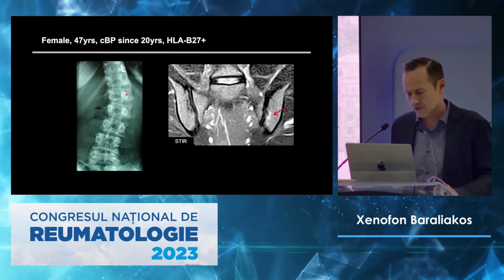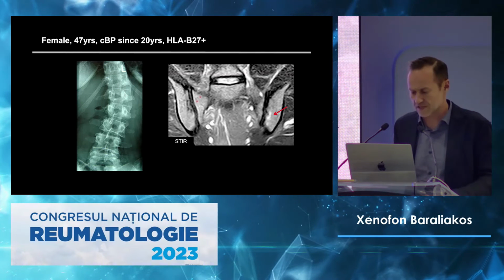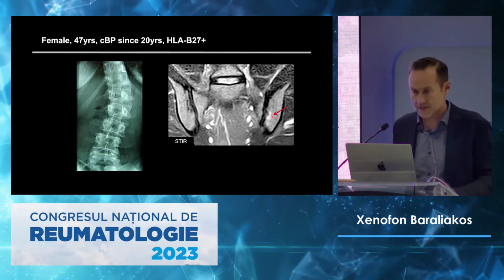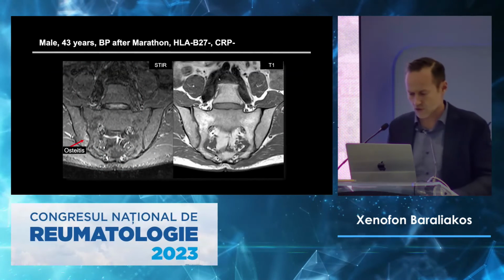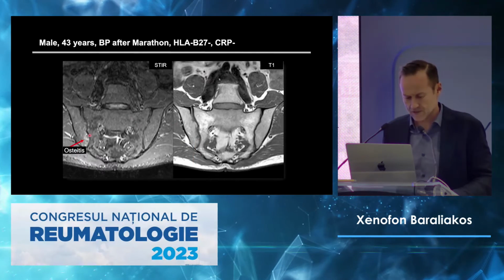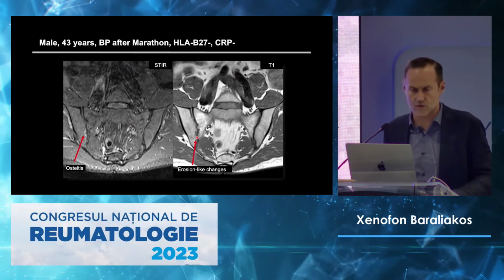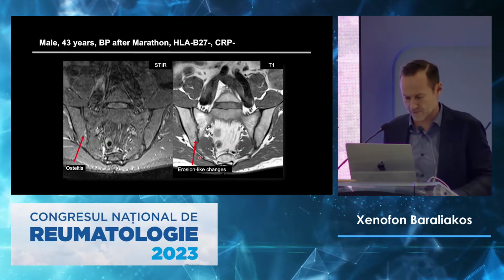When she lies down, that change here is not that prominent, but typically, obviously, the clinical part and the imaging part show us that this is not typical spondyloarthritis, and you remember this is in the front of the joint, it's very little, and it's lesser bright. So we may have also changes like these ones with very little osteitis, some what we call the erosion-like changes. This is more about degeneration in a person who is running marathon.